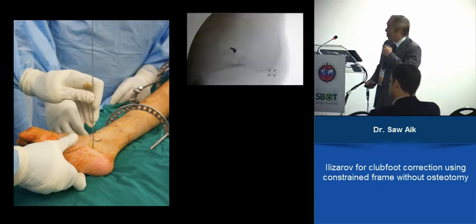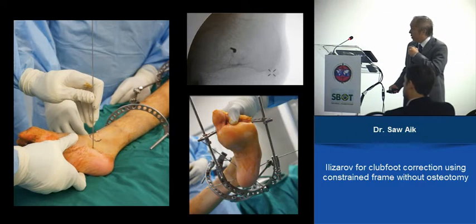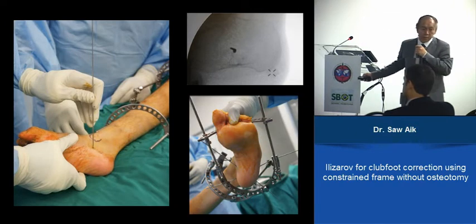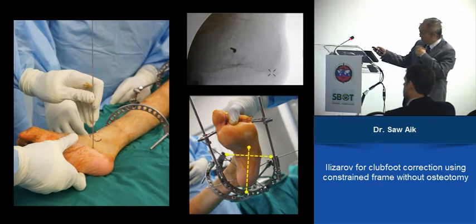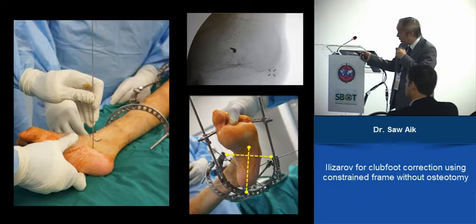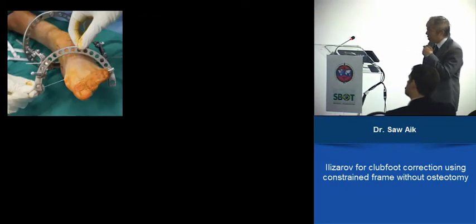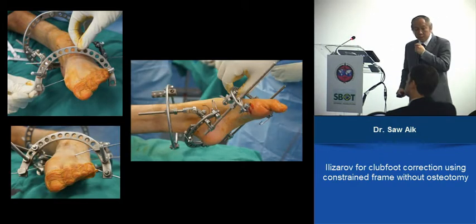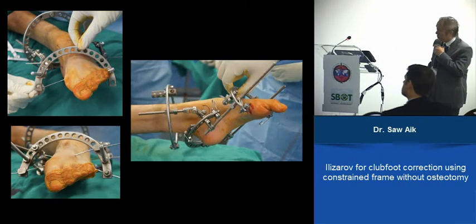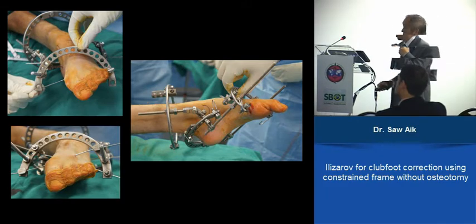You use a C-arm to check it is definitely in the bone. Then you put a ring and drill the second wire through. It's important that the hindfoot is in the axis of the five-eighths ring used here. Then first metatarsus, fifth metatarsus, then up to the tibia bone — AP and lateral view, 90 degrees to the bone. In a 17-year-old we use three half-pins to get better stability.